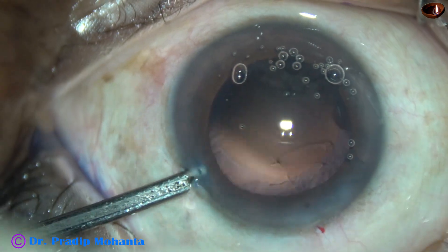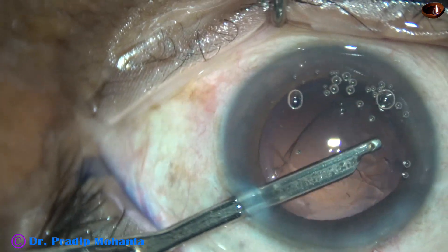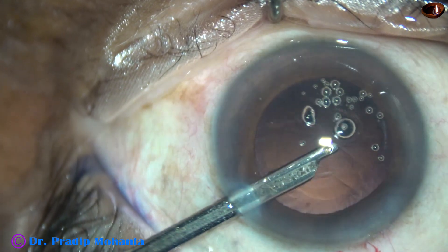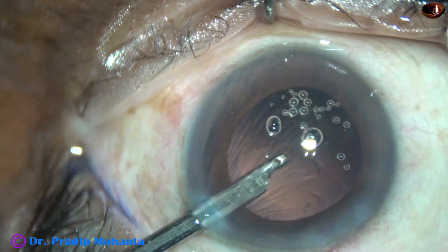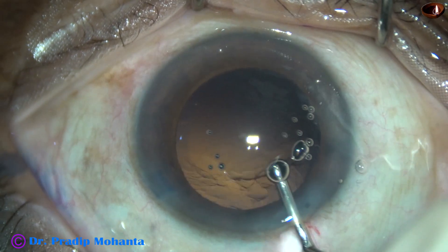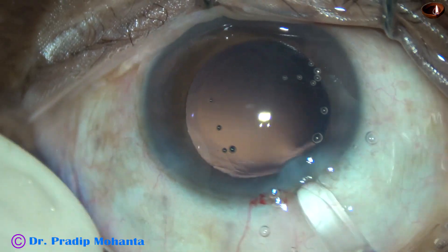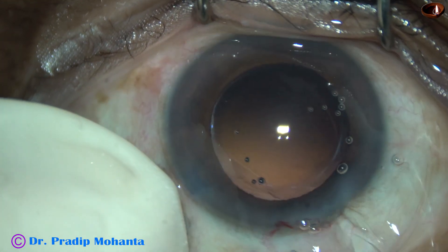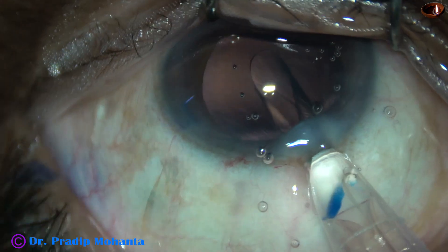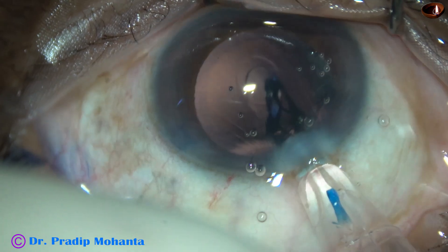Only a small bit of cortex remained in the sub-incisional area. For this I went through the side port, used the 23-gauge Simcoe cannula, and removed the remaining cortex. Visco is used to fill out the capsular bag and the anterior chamber, and then a hydrophobic acrylic single-piece monofocal intraocular lens is implanted in the capsular bag.